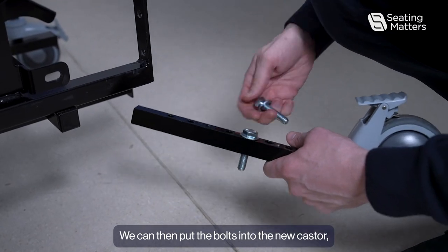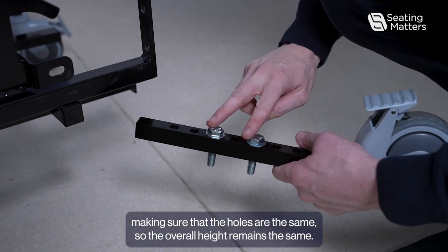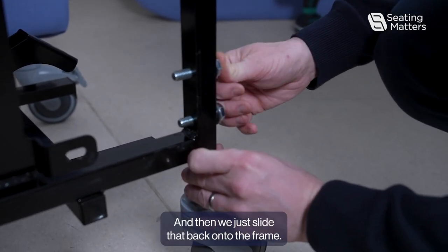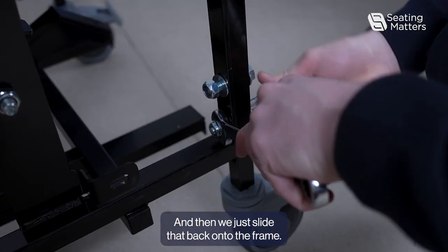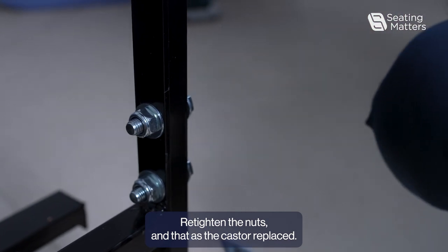We can then put the bolts into the new caster, making sure that the holes are the same so the overall height remains the same. Then we just slide that back onto the frame and re-tighten the nuts. And that is the caster replaced.